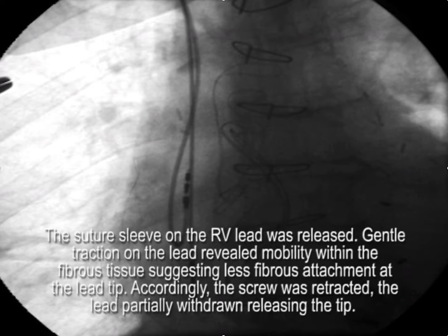The suture sleeve on the RV lead was released. Gentle traction on the lead revealed mobility within the fibrous tissue, suggesting possibly less fibrous attachment at the lead tip. Accordingly, the screw was retracted and gentle traction was added to the lead, which released the tip.